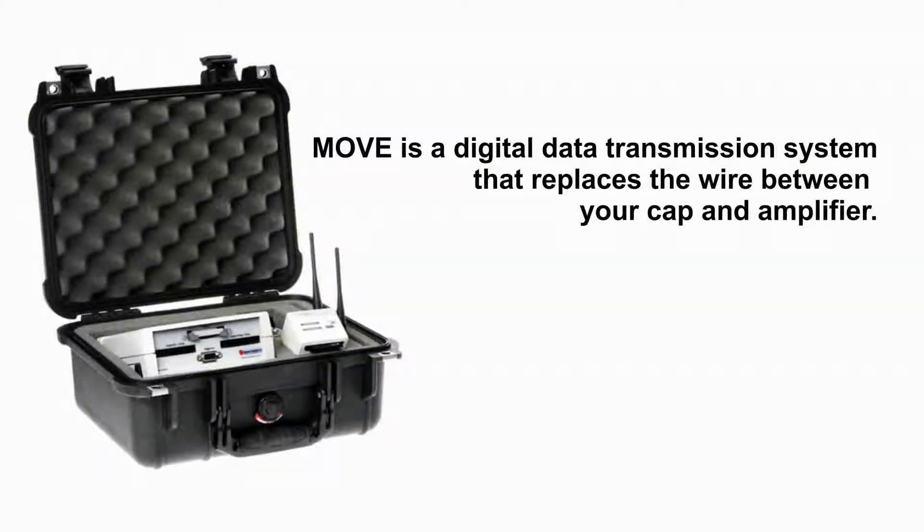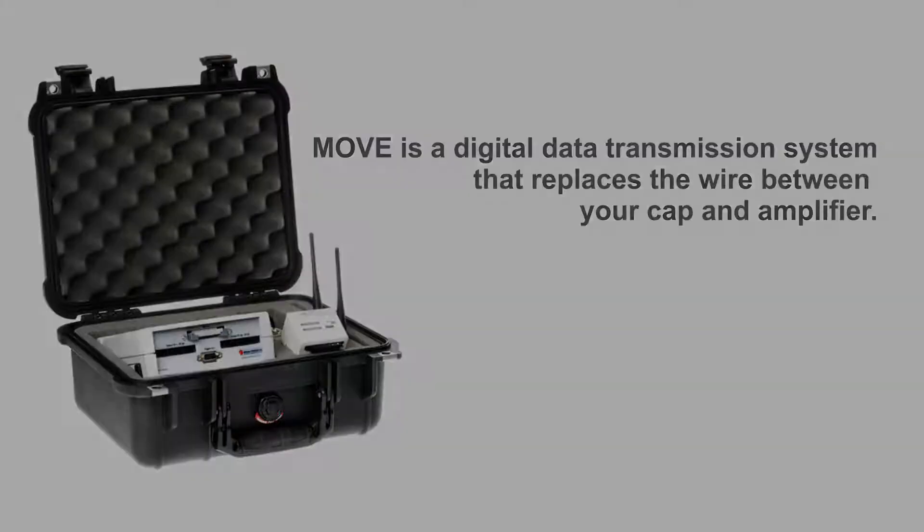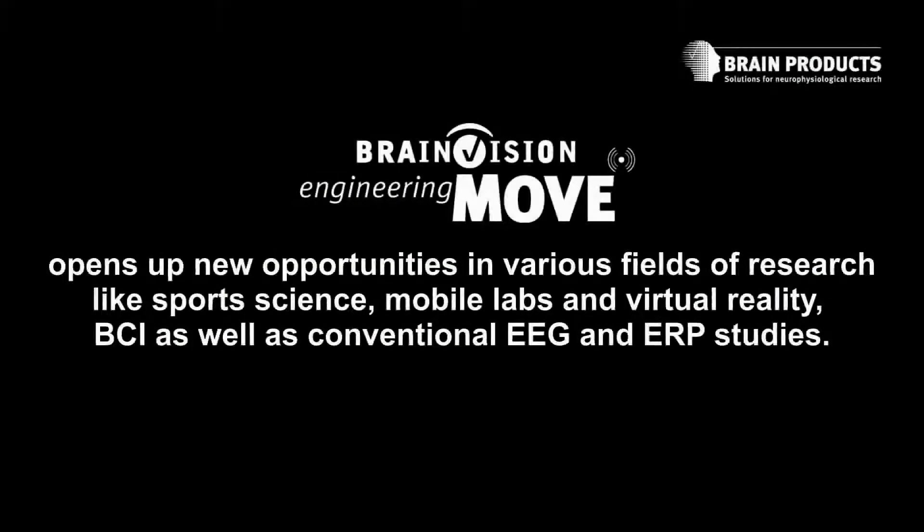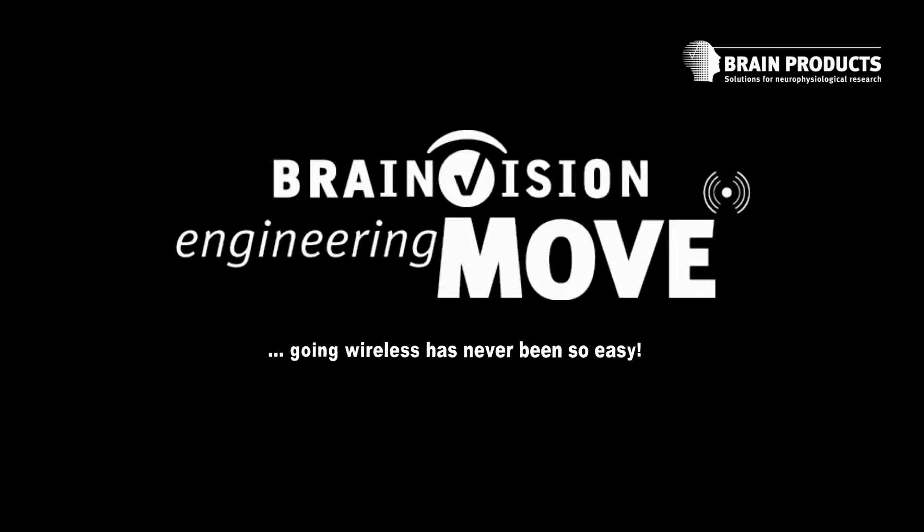MOVE is a digital data transmission system that replaces the wire between your cap and amplifier. You may keep your complete setup, including stimulation and event transmission. MOVE opens up new opportunities in various fields of research. Going wireless has never been so easy.